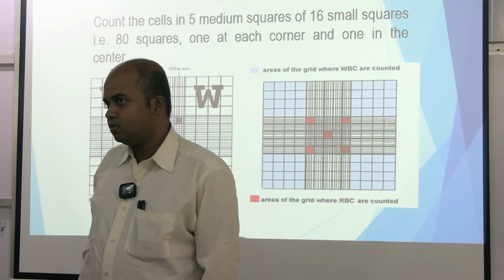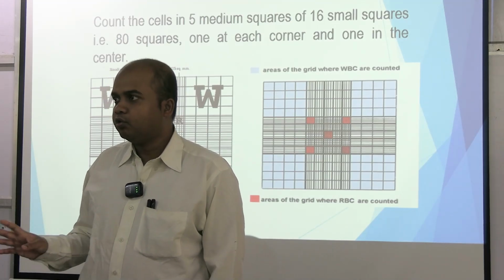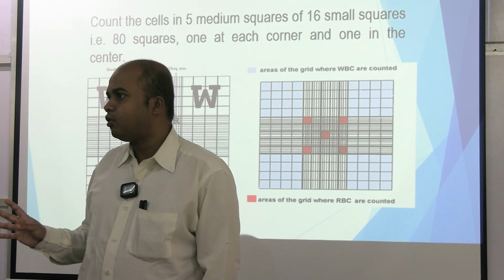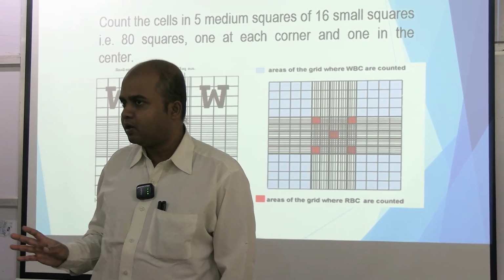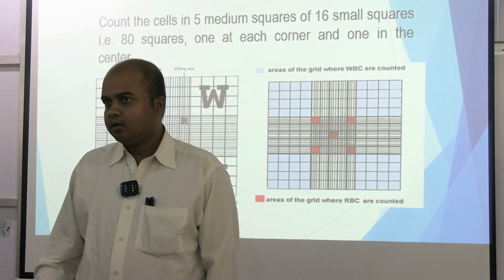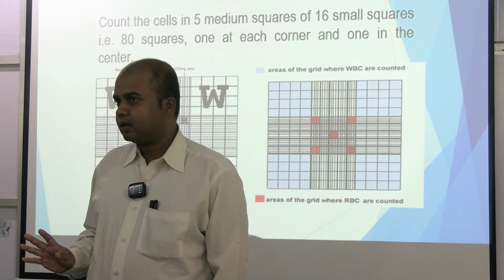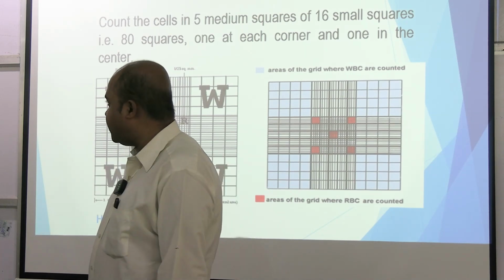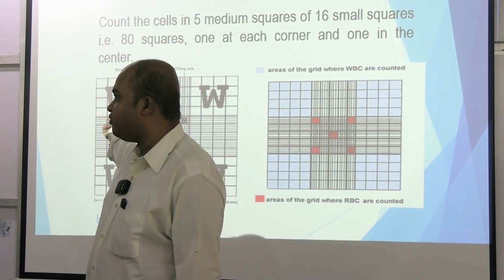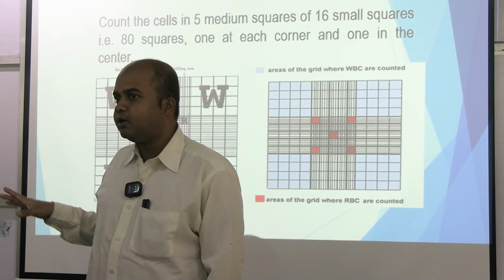So the process is wrong, because you are doing it with your own blood. We are all healthy persons, so the count should be in the normal range. Remember that at the back of your mind, but don't try to do it like that; the examiner will catch you, especially if you write 25 for this square and the same number in all squares.